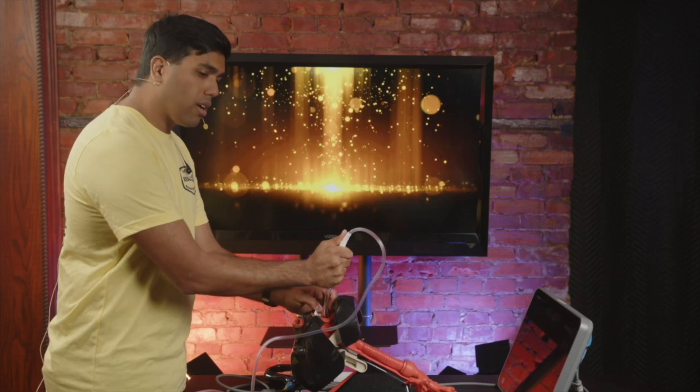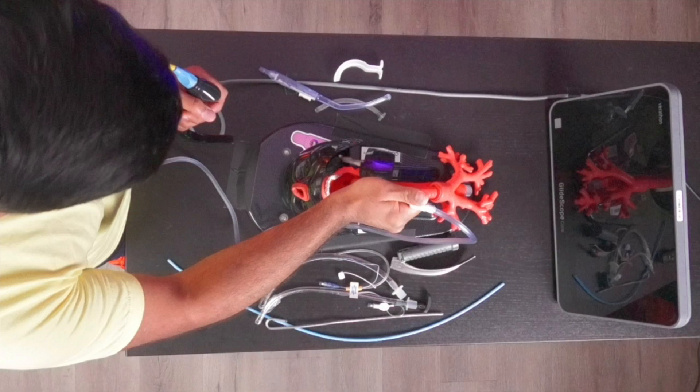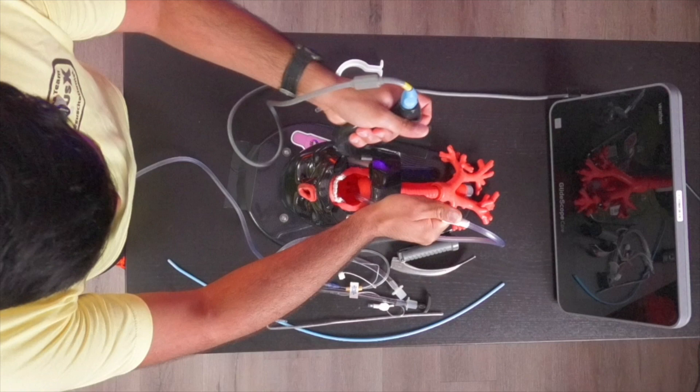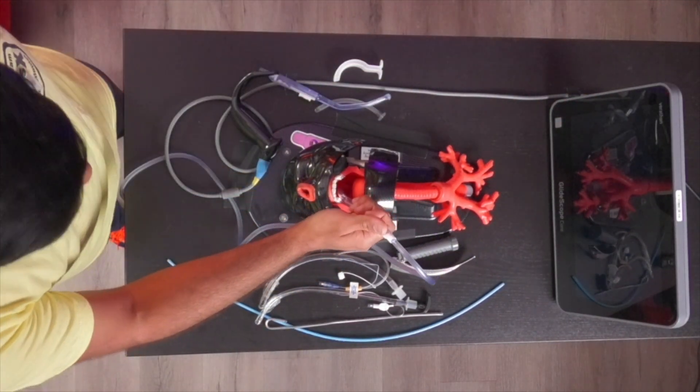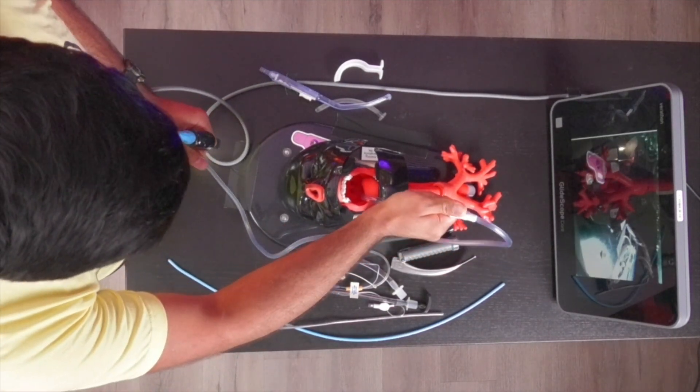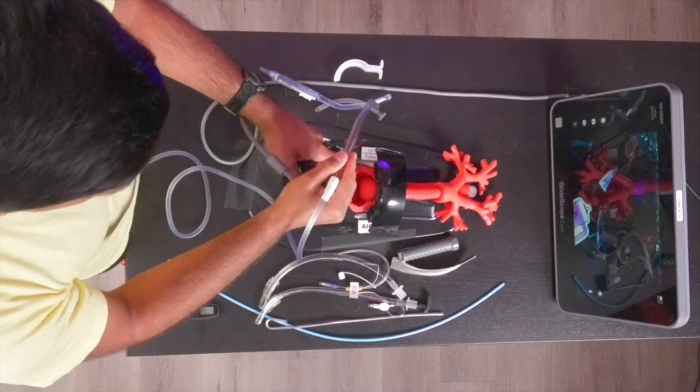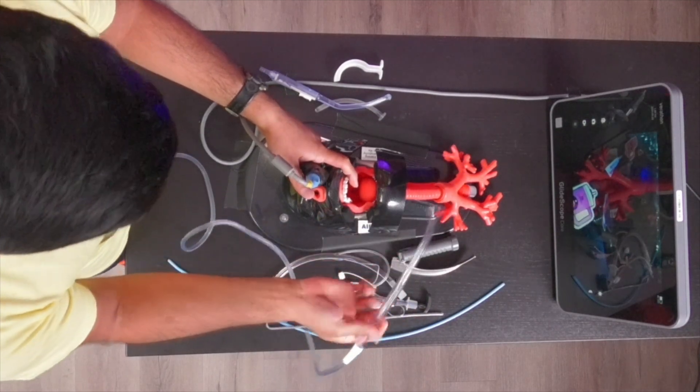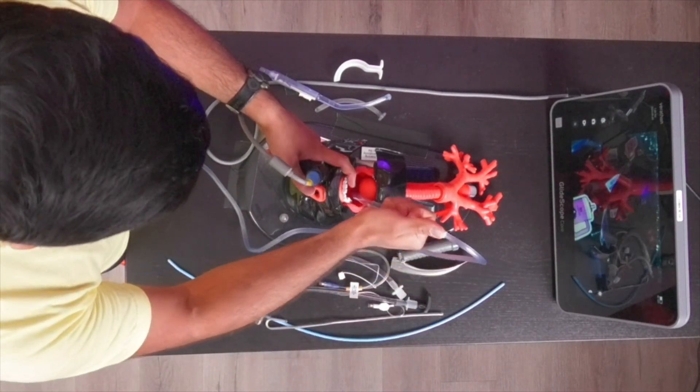Ian, can I get the overhead camera here? We're going to push the jaw inferiorly and make space within the mouth for your laryngoscope to be inserted. I'm going to turn this on so we can get that feed as well. As I'm suctioning, I'm pushing down to give myself adequate space. An important part of this is to make sure the cervical collar has been removed and somebody's maintaining inline stabilization from the bottom side of the bed.